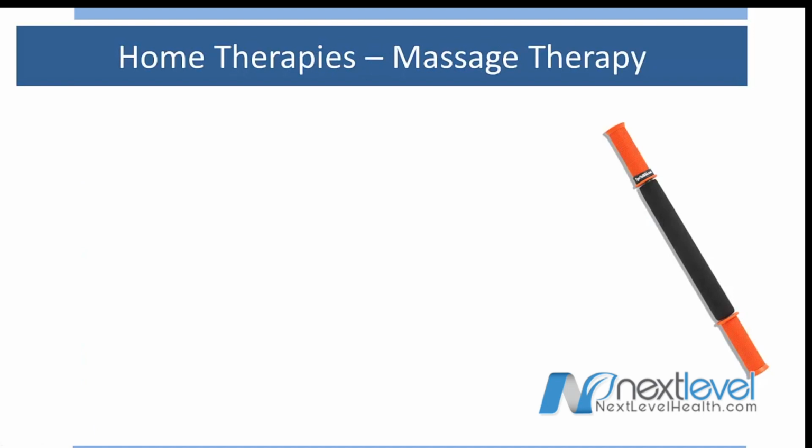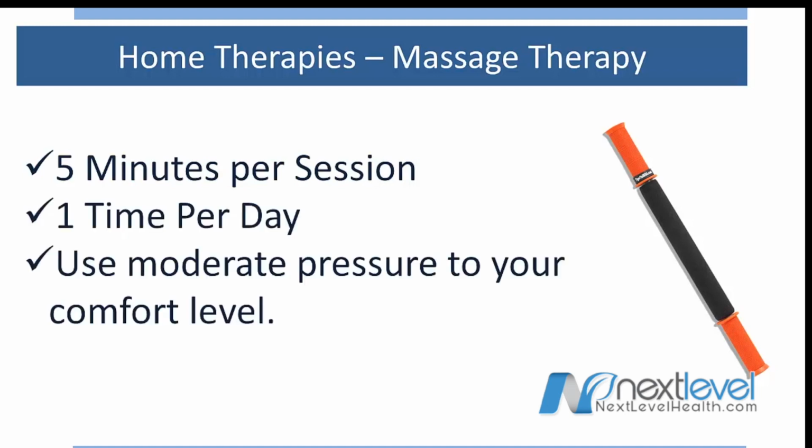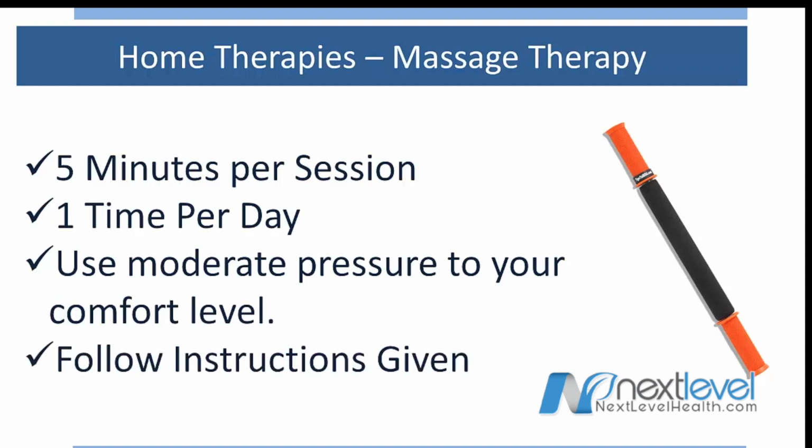The massage stick is going to help to decrease muscle spasms and also help get more blood flow down to the feet. You're going to do it for 5 minutes per day. You're only going to do it once per day. And then when you're using it, the pressure that you feel should be moderate. It should be comfortable. It shouldn't cause any pain or any problems, and it shouldn't hurt when you do it. And also follow the instruction sheet that we gave you.